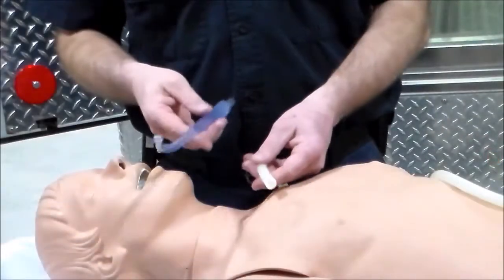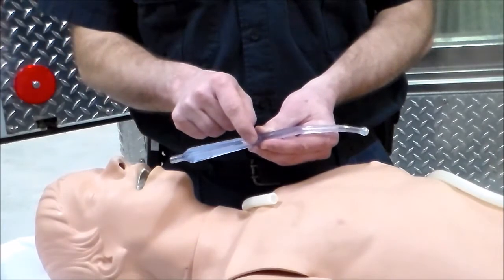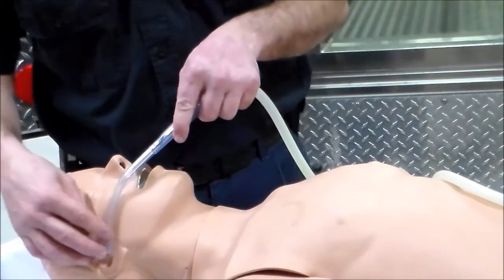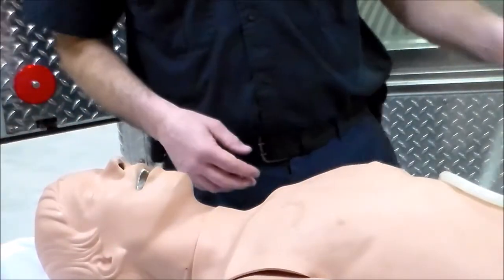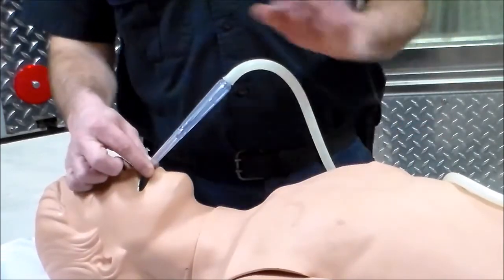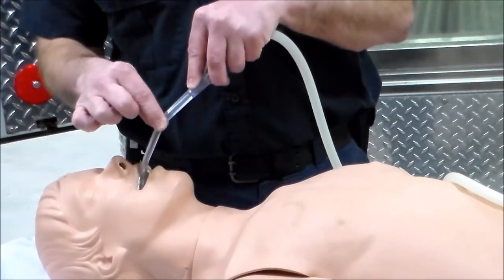Now let's take a closer look. Here is the non-kink tubing and here is the Yankauer — notice the opening where I place my finger over it. I attach it, then measure just like I would for an oral airway. Once marked, I turn on the suction unit. I insert the catheter, and because I've inserted it to the marked point, I can press my finger over that opening and suction back and forth to remove all secretions from the airway.